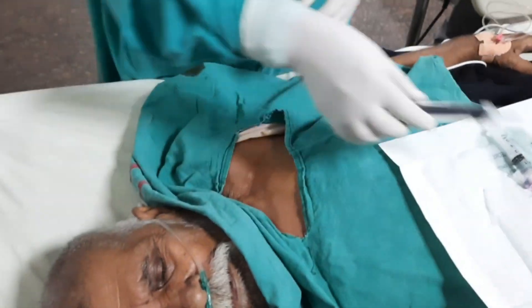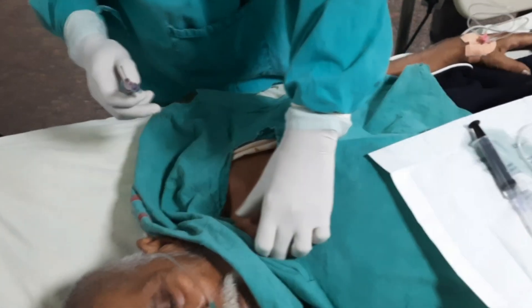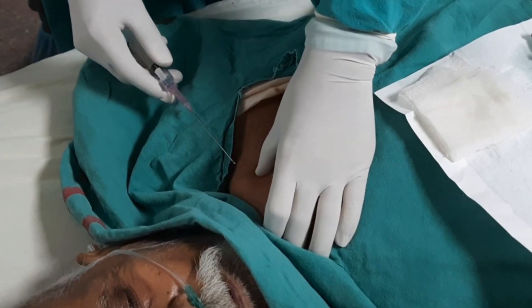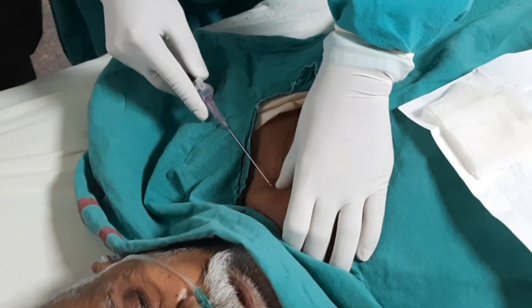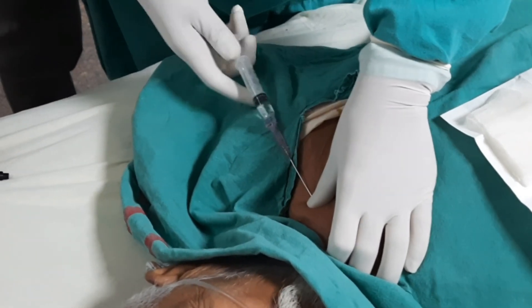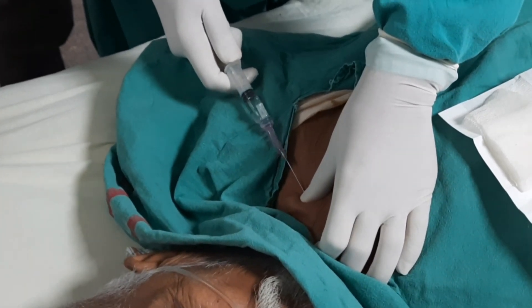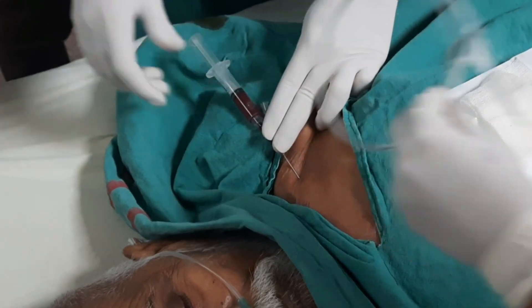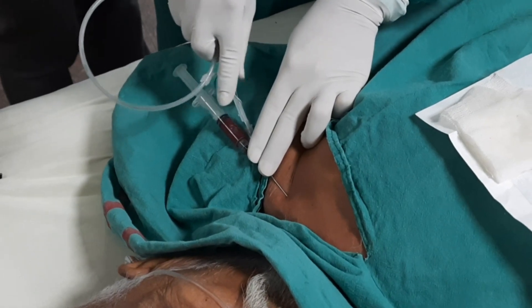After preparation, we will give 3 to 5 ml of 1% lignocaine at the central line site in a fanning manner. Then we will take the 18-gauge needle from the central line kit. Our insertion site is at the middle two-thirds and lateral one-third junction. We insert the needle at a 30-degree angle, hit the clavicle, press with the thumb, take negative suction, and advance inside parallelly until blood comes.